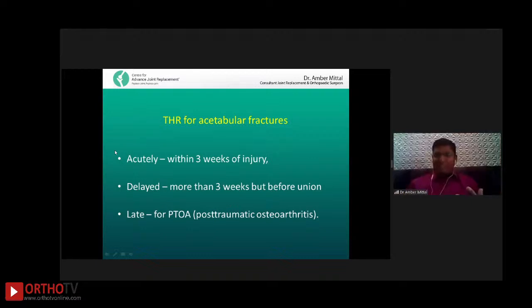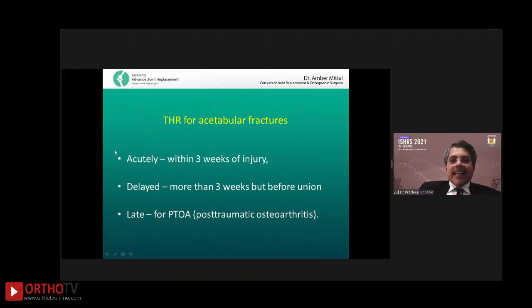The only fear that you get is that you do not want to explode the pelvis. You want to contain it, because I got a good feeling of that press fit with that cup. If I had gone to a higher reaming size, I was worried that I might open up the pelvis. So I did not want that. It was my feeling. It never opens up.